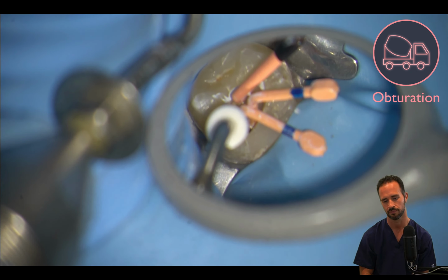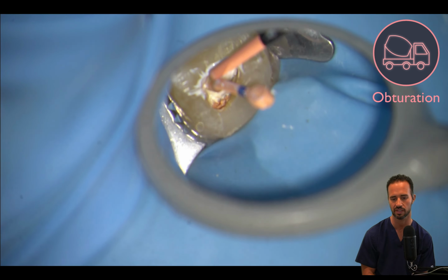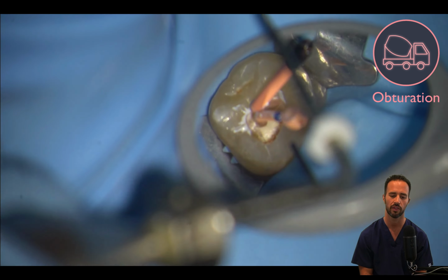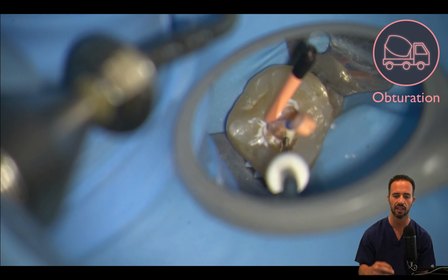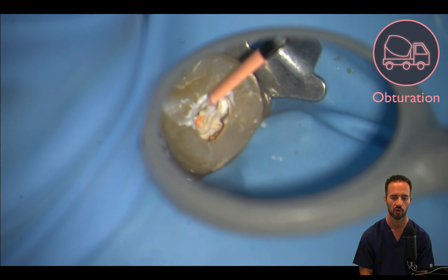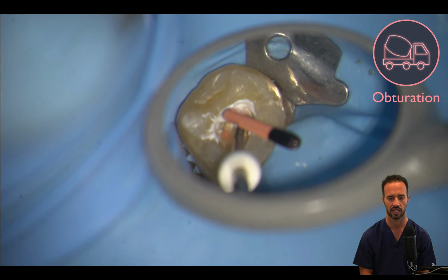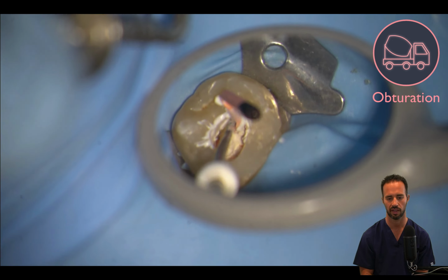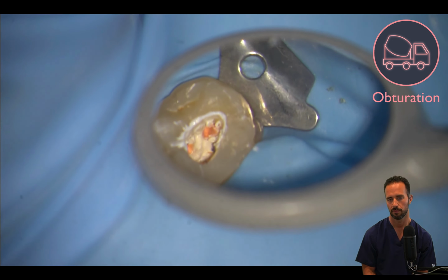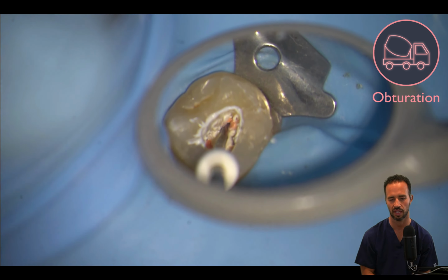And so now we're going to go ahead and sever off the gutta percha cones right at the orifice with our System B with the Buchanan Fine Medium 08 tip, and just burning them off right at the orifice level. Our buccals, and then now our palatal canal. But, you see the framework is always the same regardless of the case complexity.